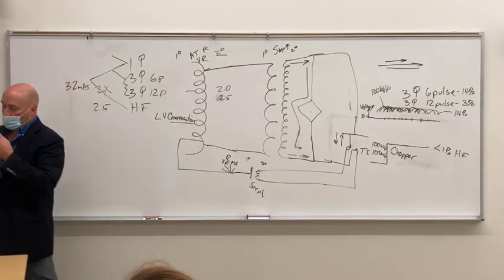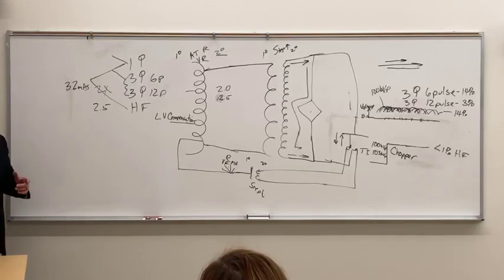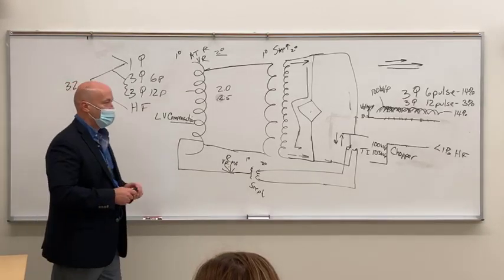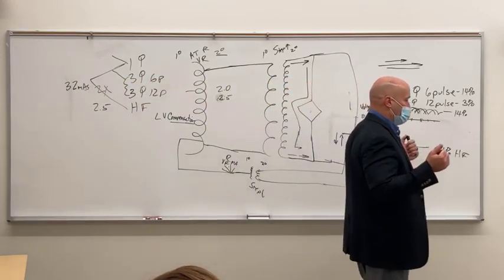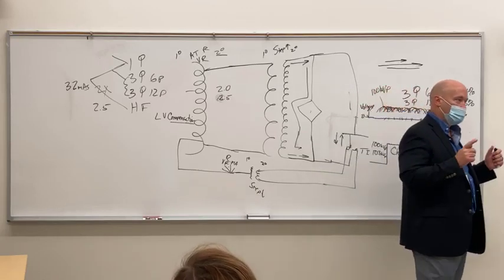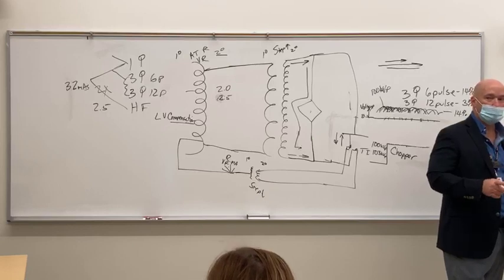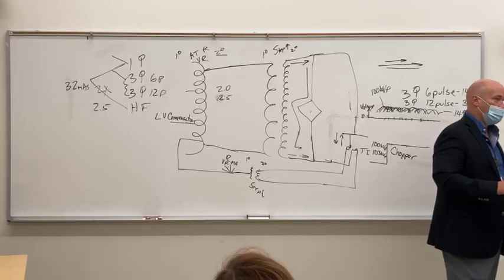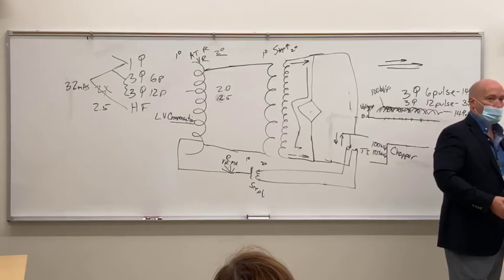Okay. So we do have a couple of different types of generators as well, and you may or may not see either one of these. First is what we'll call a capacitor discharge unit. Does anybody work with a portable machine that feels really, really light, and in order to use it, I'm not talking about to charge the batteries, but to make any kind of exposure, you take it up to the patient's room and you plug it into the wall before you can shoot with it?